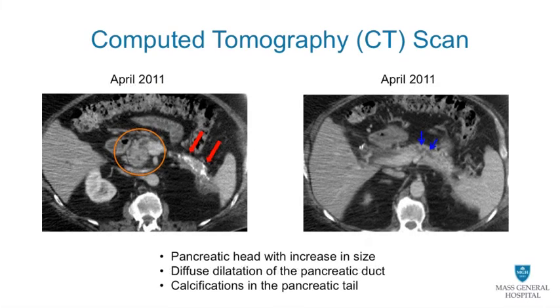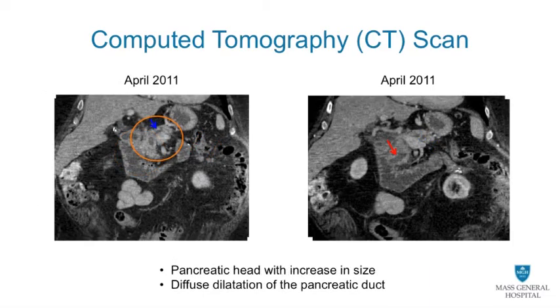However, the subsequent CT scan performed in April 2011 reveals an increase in the size of the pancreatic head, marked by an orange circle, and diffuse dilatation of the main pancreatic duct, pointed by blue arrows, as well as calcifications of the pancreatic tail. Taking a closer look, a 4.9 x 4.6 x 3.0 cm mass is identified in the pancreatic head with associated pancreatic and bile duct dilatation, indicated by blue and red arrows respectively.